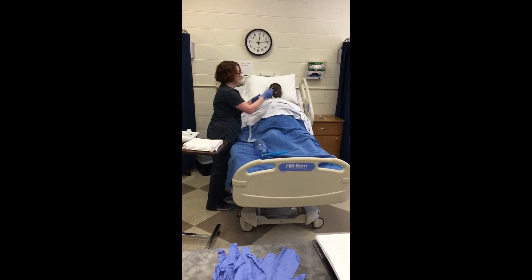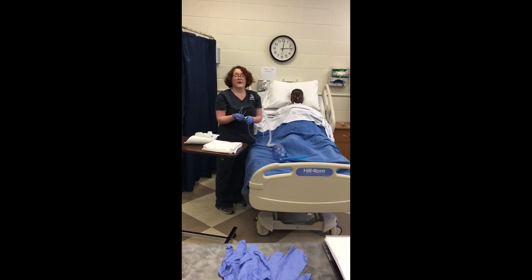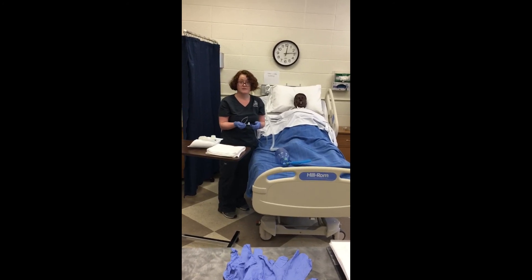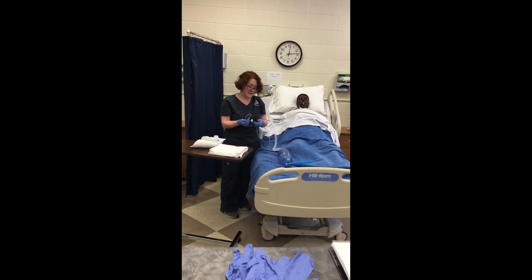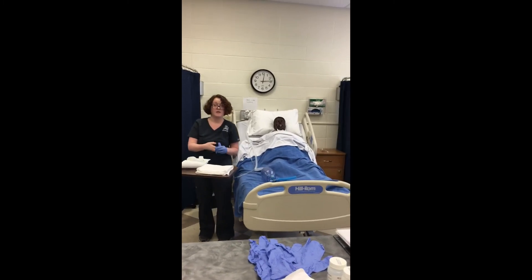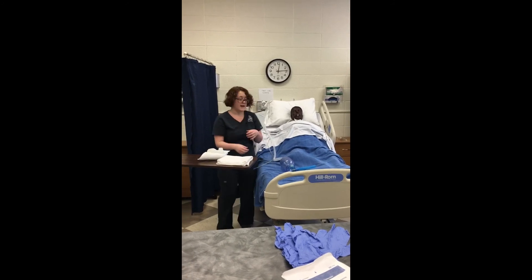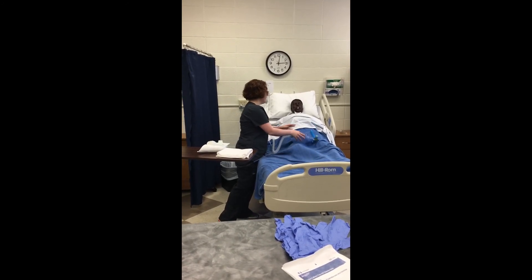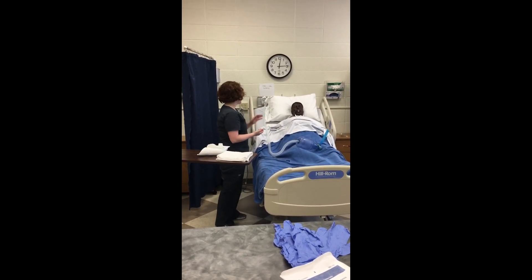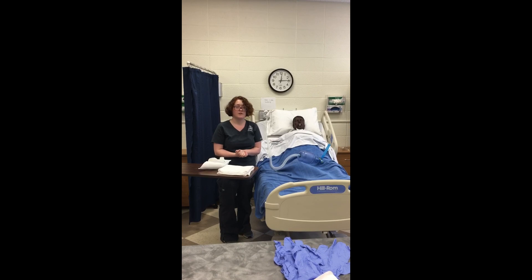I'm going to assess the need for repeating. In this case it doesn't need to be repeated, but if I did, I would wait 30 seconds to 1 minute, and I would not perform the procedure for more than 5 minutes to prevent the patient from becoming too deoxygenated. Then I'm going to remove this, wrap it in my glove, and dispose of it. I'm going to perform hand hygiene, reapply any oxygen, and restore it back to its normal settings. I'll get the client into a comfortable position and assess their toleration of the procedure, then document.